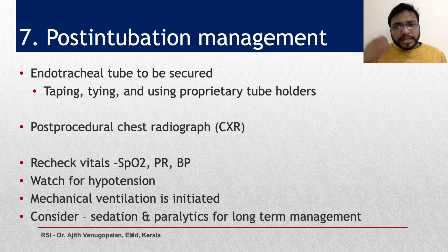Then you can use one more fixing that goes through the oral airway. Along with that, there are other methods of tying, where you can tie it and fix it. There are tube holders.